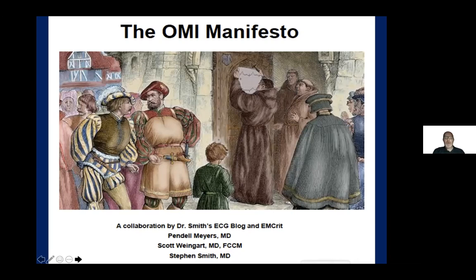So it is possible to have a false positive, but in this STEMI and NSTEMI paradigm, if we're using ST elevation to define a transmural infarct, then one theoretically could not have a false negative, right? Because if there's no ST elevation, then you're not going to call it anyway. Hopefully that makes sense, but that puts us into this paradox: STEMI is a specific EKG manifestation of acute coronary occlusion. It's but one.